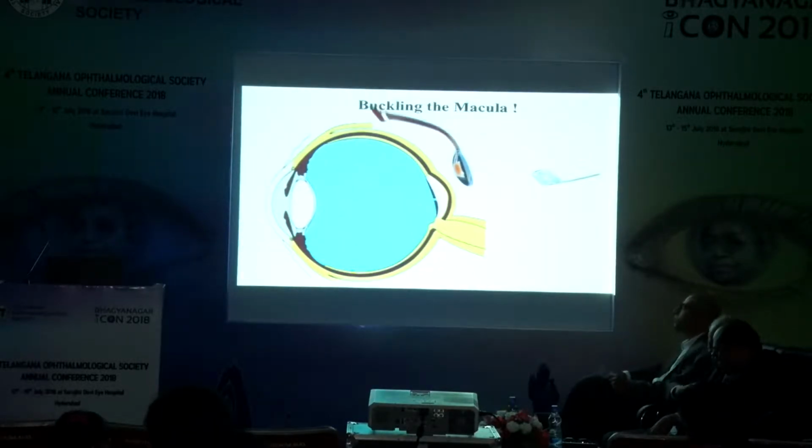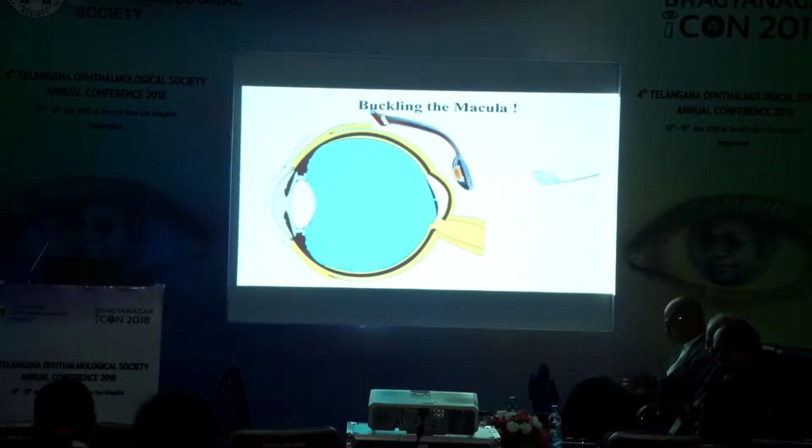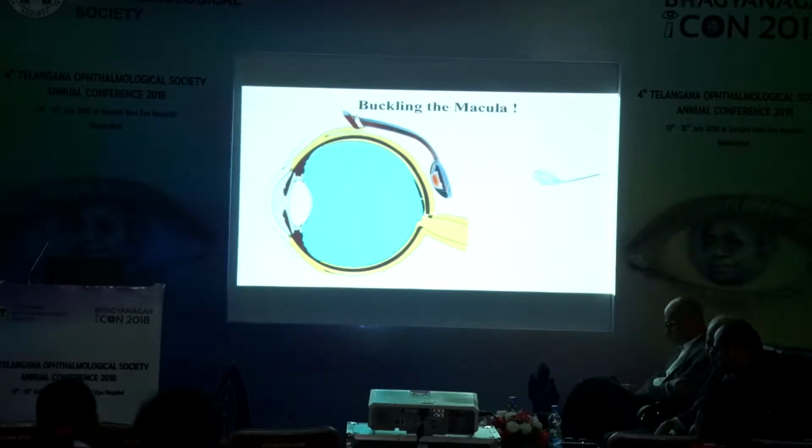Macular buckle surgery is emerging as a promising modality in the management of a macular hole with associated retinal detachment in patients with myopic traction maculopathy. The macular buckle is a medical grade silicone implant, a product of France Chirurgie Instrumentation. It is available as a sterile, biocompatible product and indicated for single use. Macular buckle enables episcleral macular indentation of the posterior staphyloma, relieving the vitreoretinal traction and opposing the retinal pigment epithelium to the neurosensory retina.